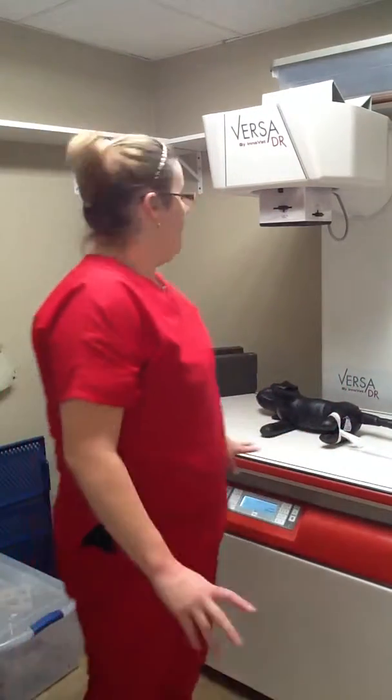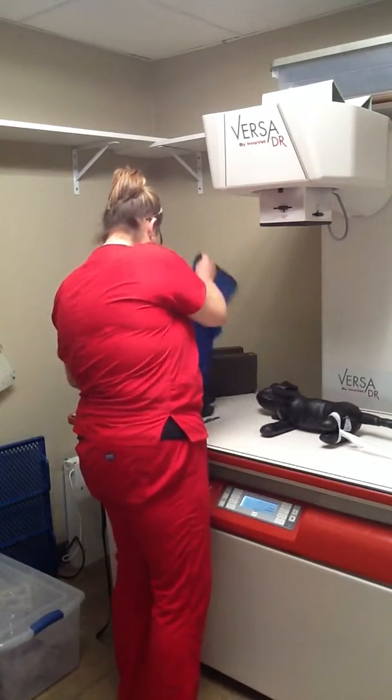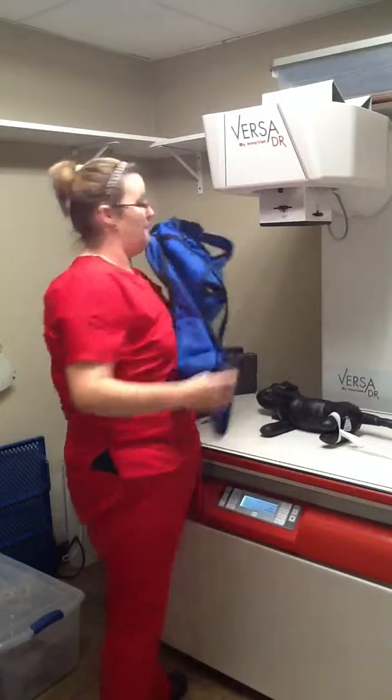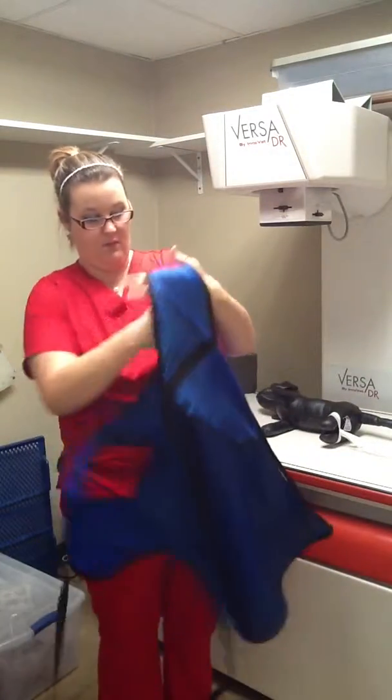Hello, this is McKayla Davis. This is the second part of my video. I'm going to demonstrate my protective gear. This is our lead aprons. We have 3 of them.